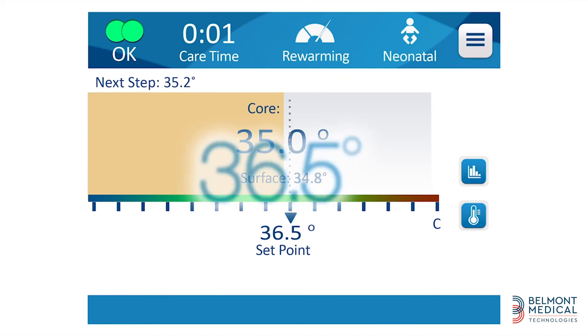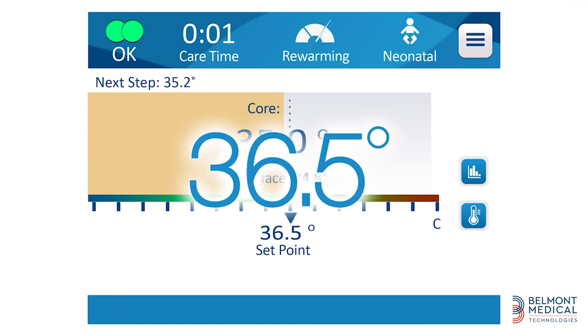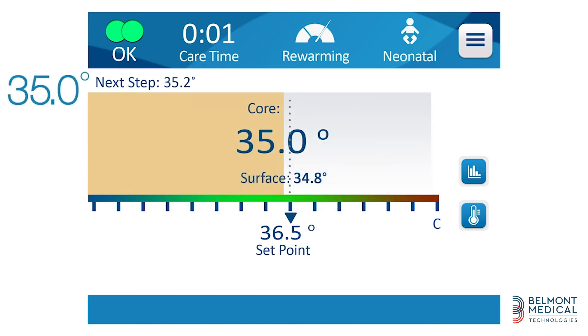The pre-programmed target temperature is 36.5 degrees Celsius, in a stepwise fashion of 0.2 degrees Celsius per one hour. Those settings can be changed per the clinician's discretion. The system will reach the desired temperature and maintain it until the treatment is complete.